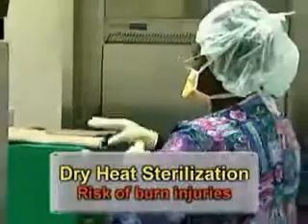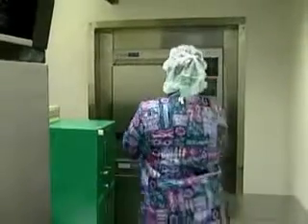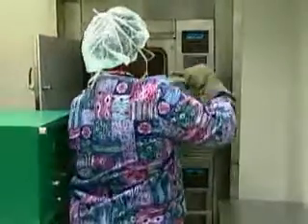The most common safety hazard associated with dry heat sterilization is burn injuries from touching the surfaces of the hot sterilizers or items. Operators should use protective equipment, and packages should be cooled before being handled or removed from the dry heat sterilizer.